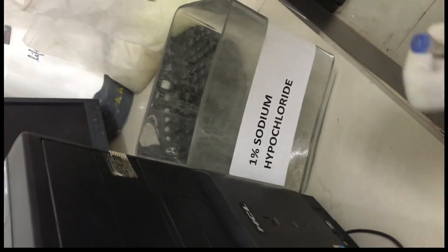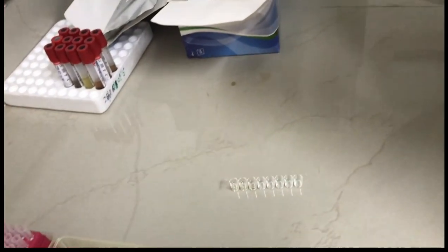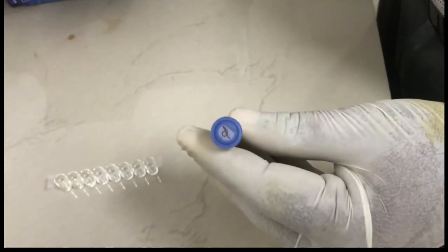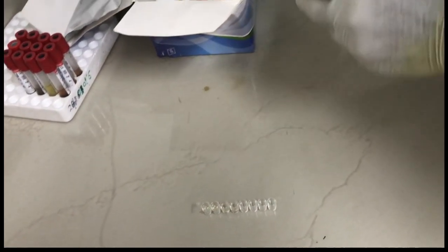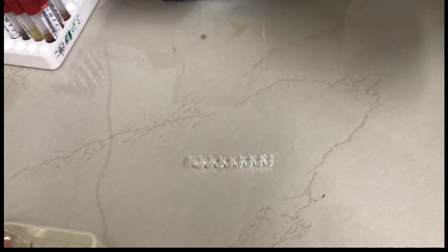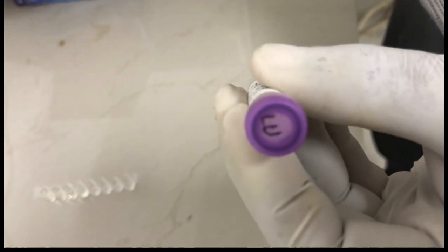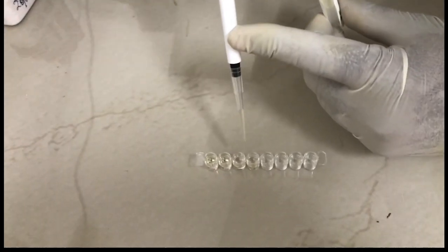Discarding the tips in one percent sodium hypochlorite. Now we are taking control D. Control D is being put into the fourth well. This is control E, which we will take as the fifth control and put into the fifth well. 50 microliters of each is being put into the wells.